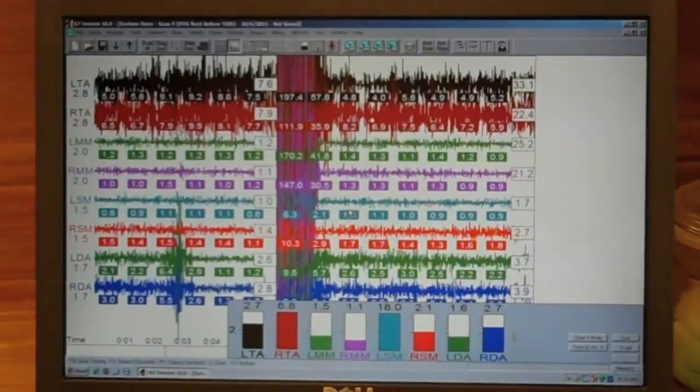This helps us determine what is going on in her body in a way that we can't determine any other way. When we place an orthotic — a jaw repositioning device that will help her muscles relax — we can put her back on this and measure the value of what we're doing, tweaking her jaw position to really help her get through her migraines and other problems.